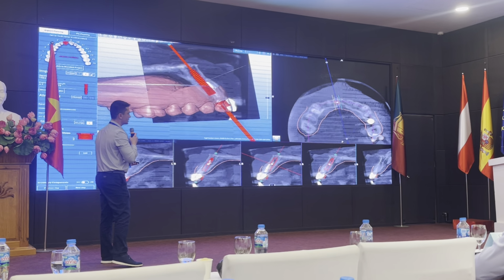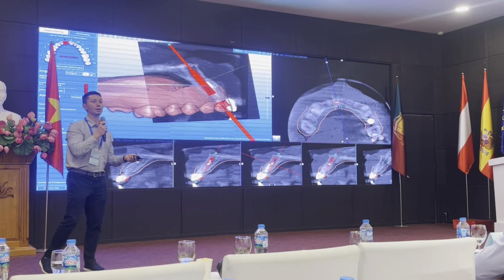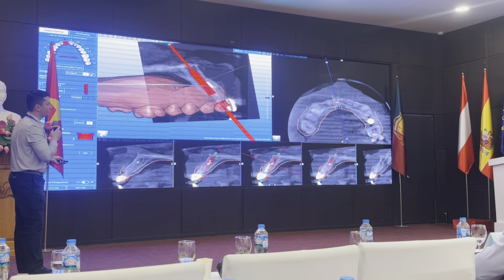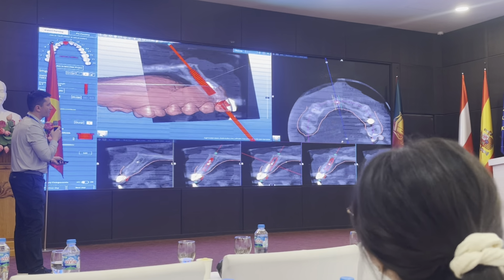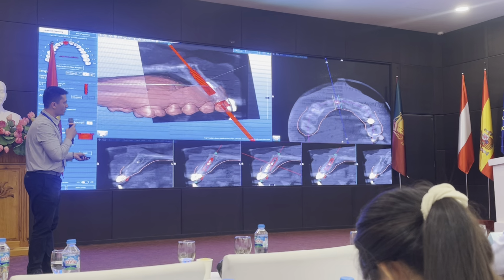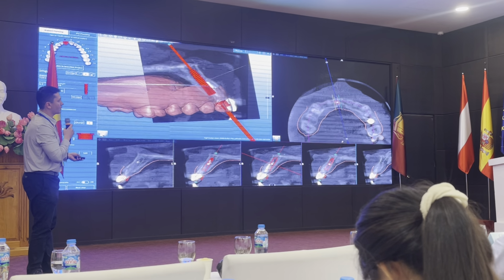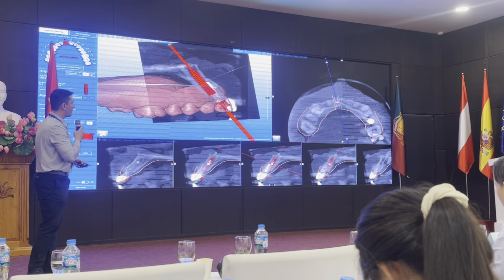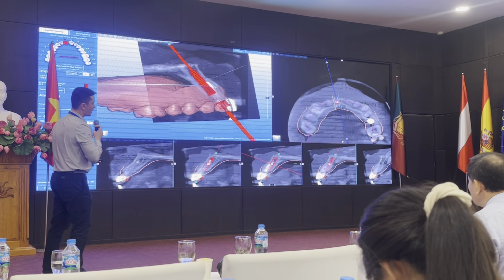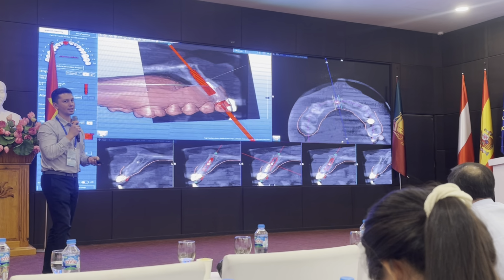If you look real closely, you can see a green line, a green halo around the implant. This is our safety zone. So we have to maintain a 2mm space for ideal bone vitality. So that's what we want to maintain here: we want a large enough implant that will give us the primary stability and the emergence profile that we want for his tooth. But we also want enough bone surrounding the implant to maintain bone vitality.